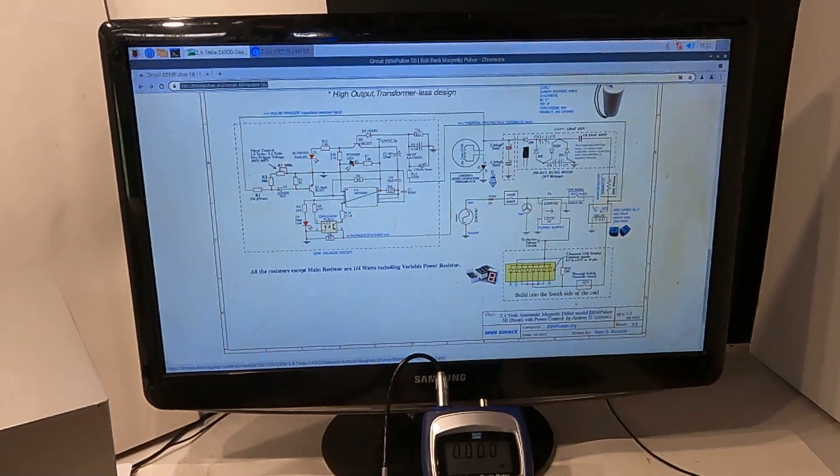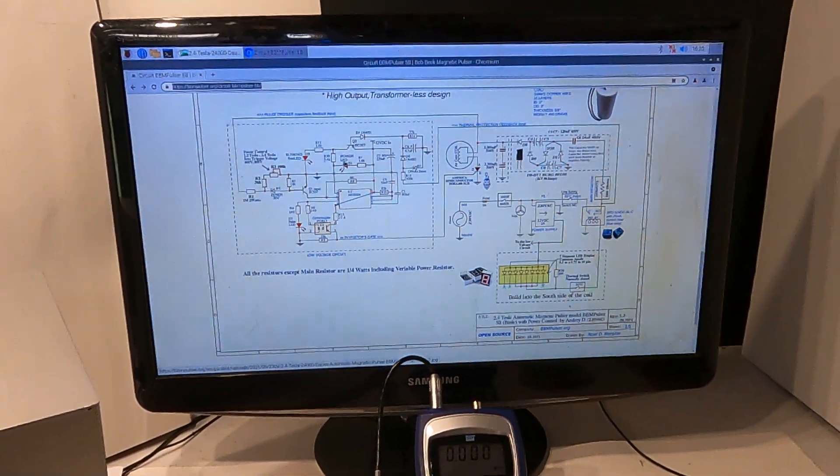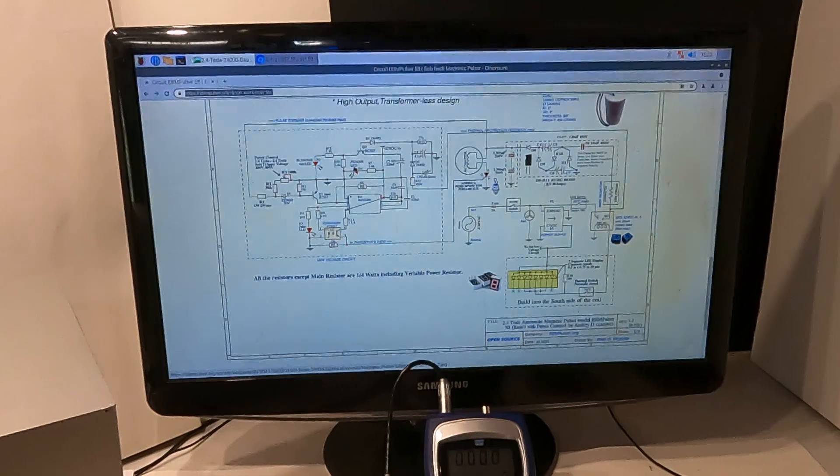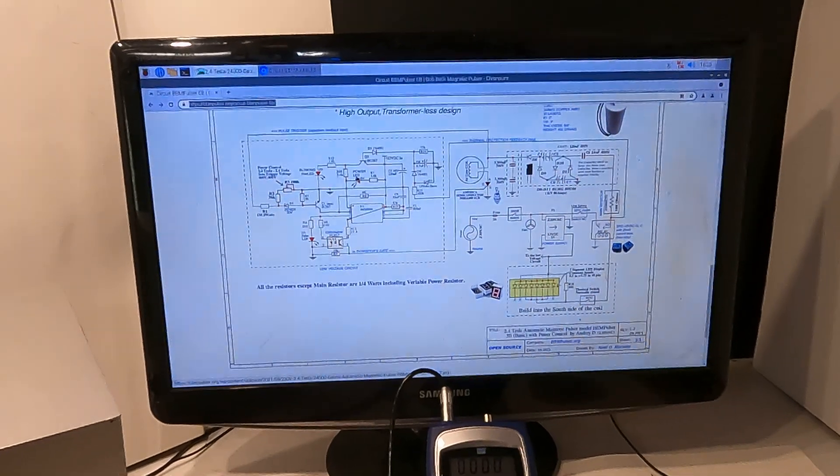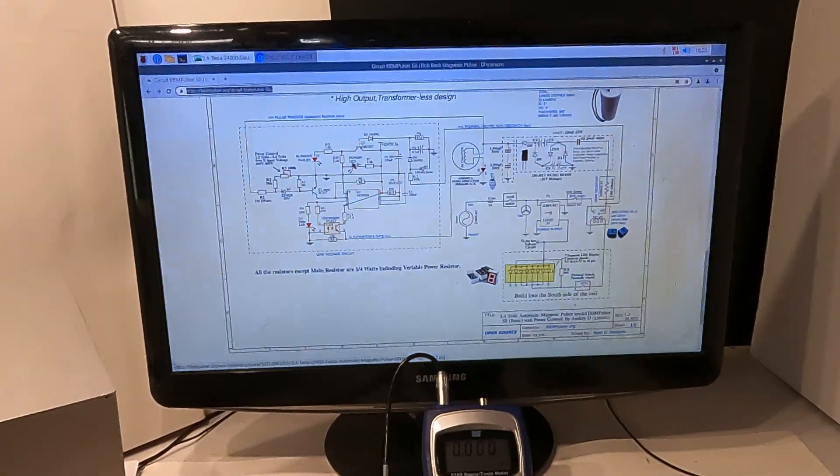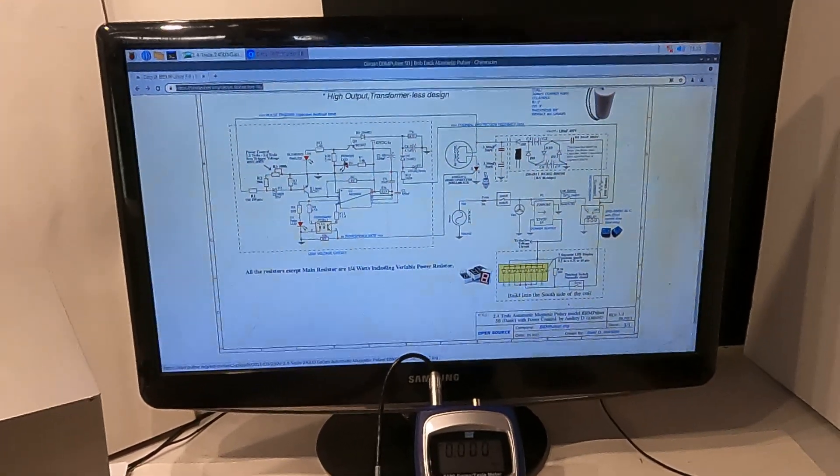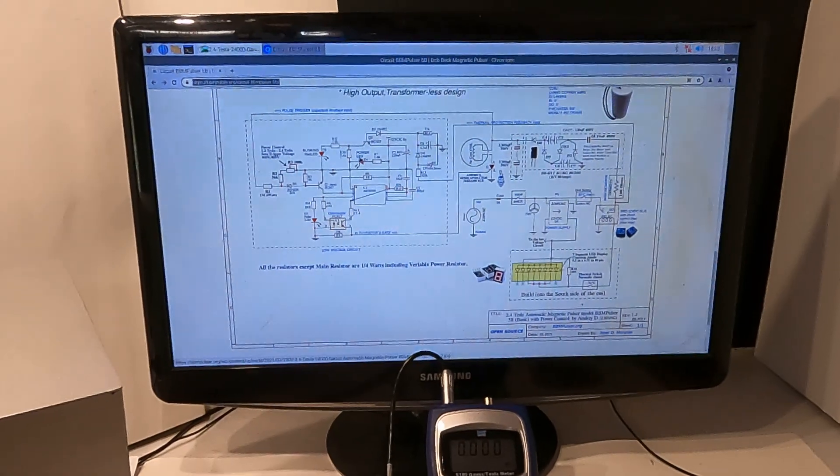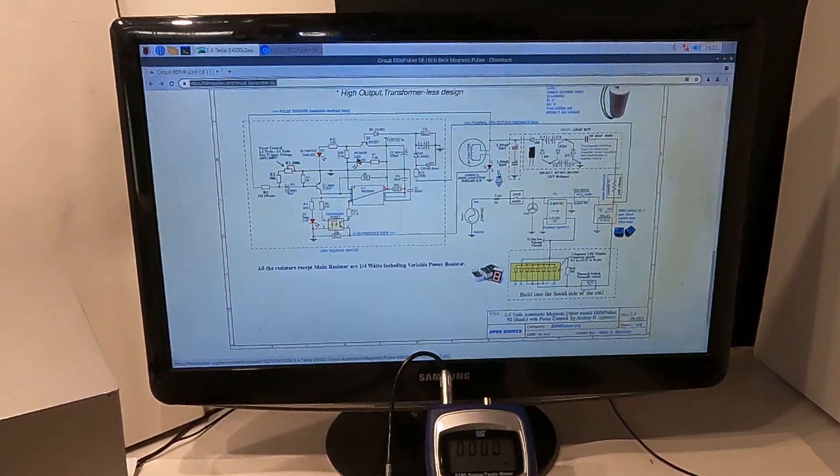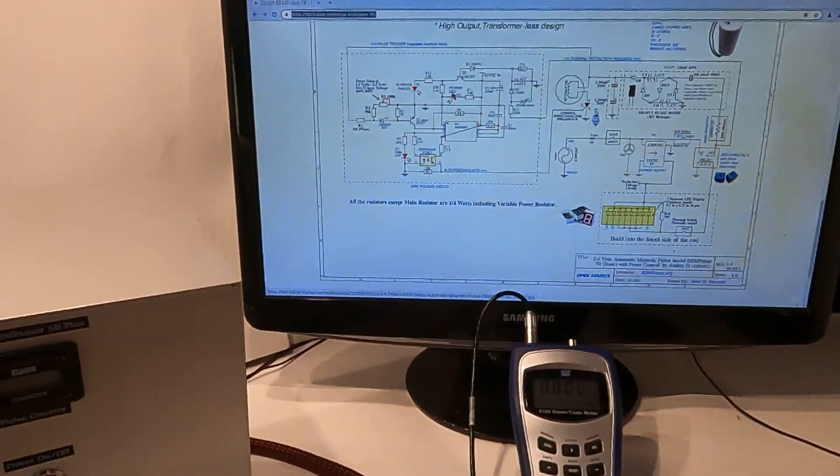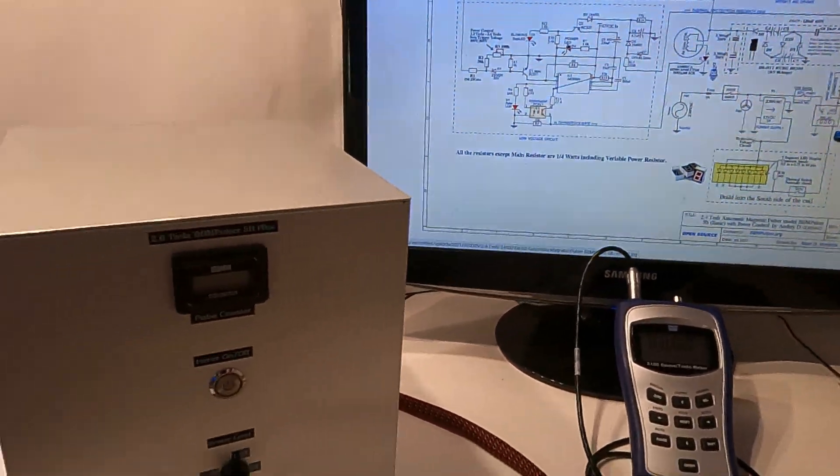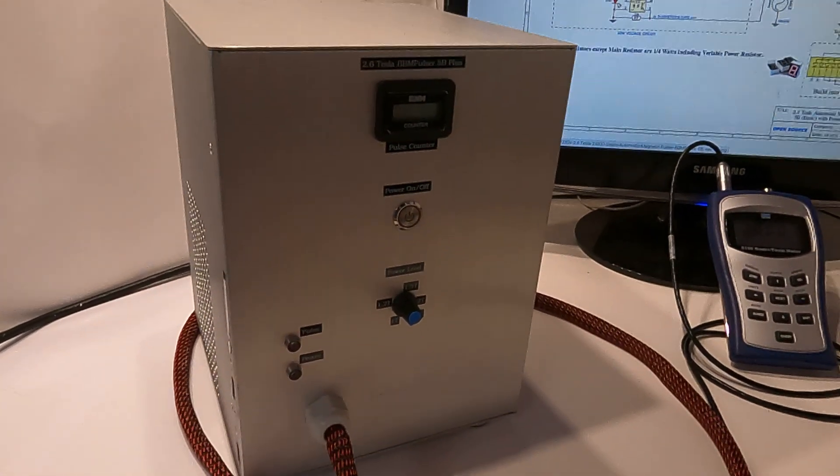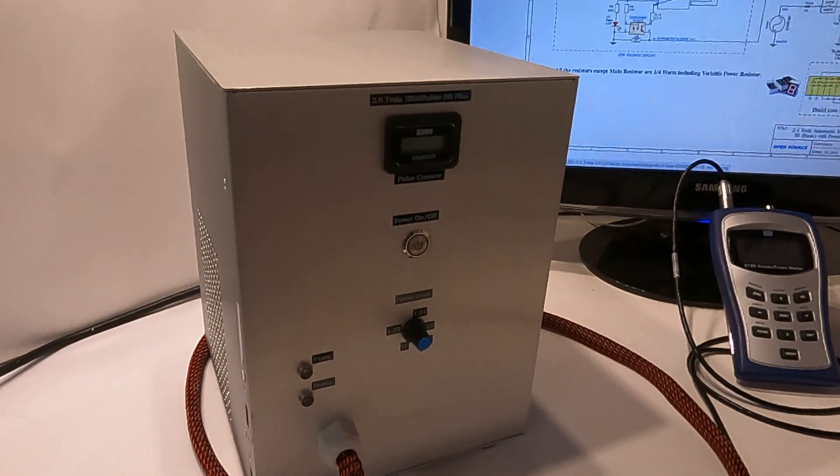Welcome to open source BBM Pulsar. Here we discuss magnetic pulsars and different PMF configurations. In this video I'd like to show you one of the models.